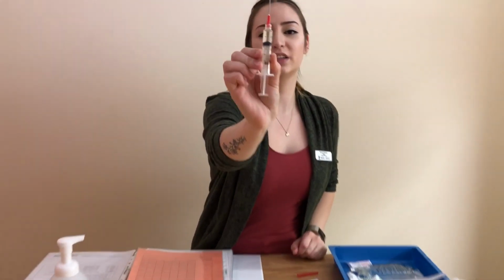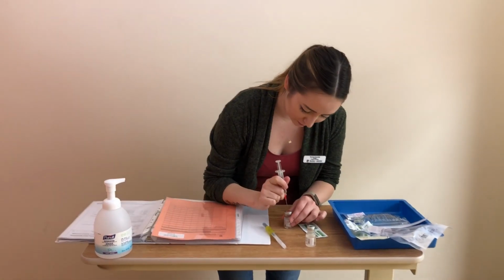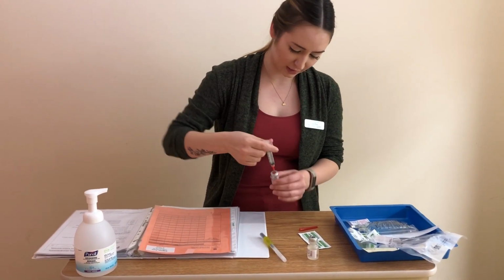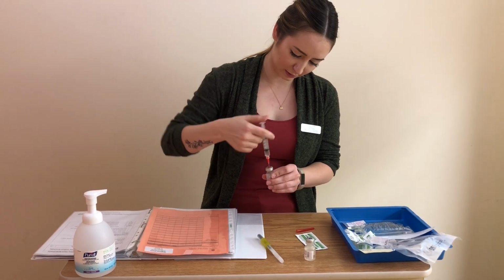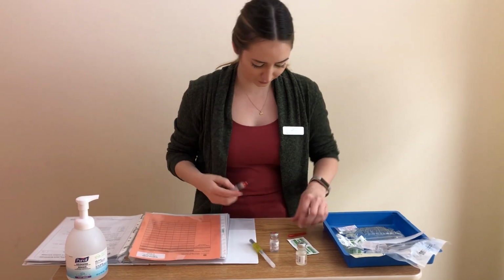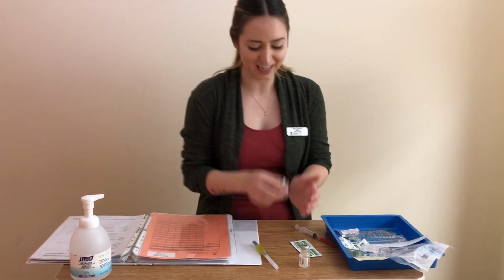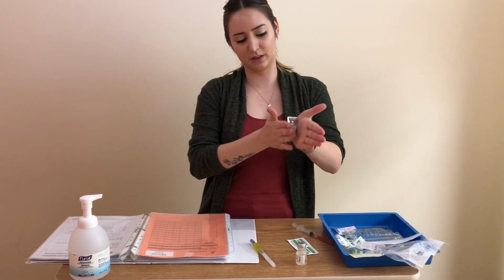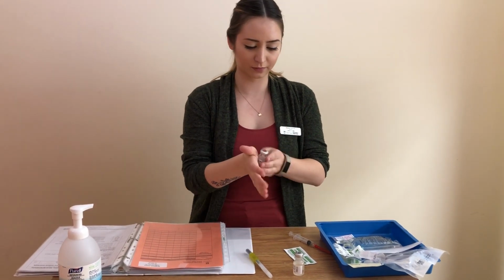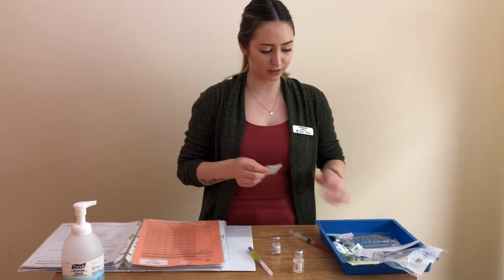So I've got my 2 milliliters of sterile water, which I'm going to put into my drug vial. Let back the air. Okay. I'll use my scoop method. Now I'll roll it between my palms gently so that I don't create any air bubbles. And once it's fully dissolved, I can now pull up my dose.